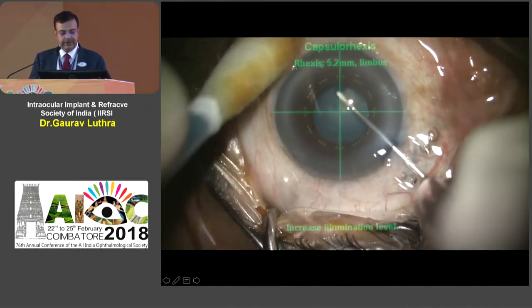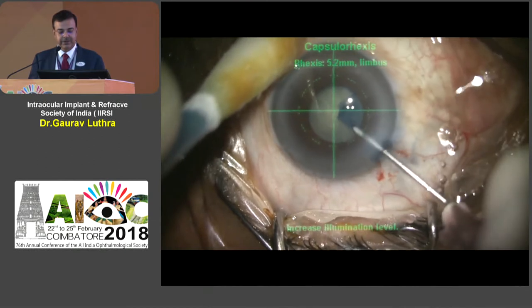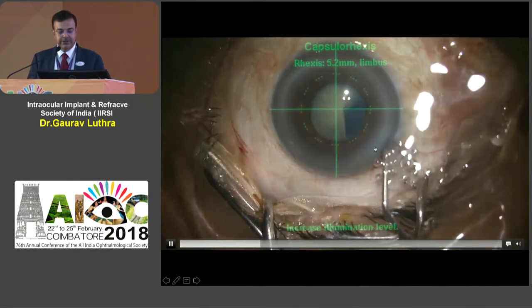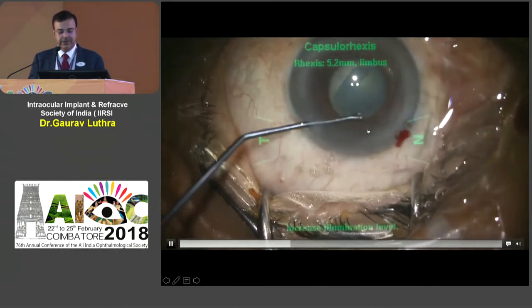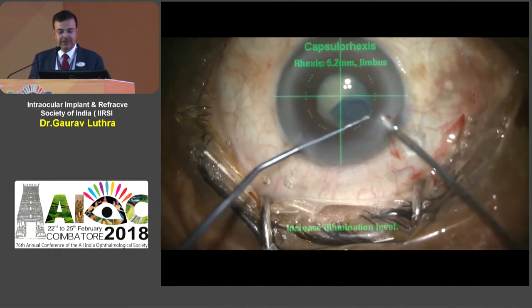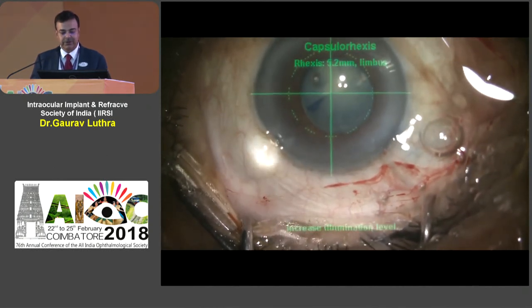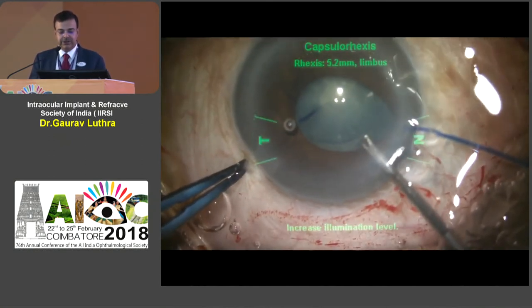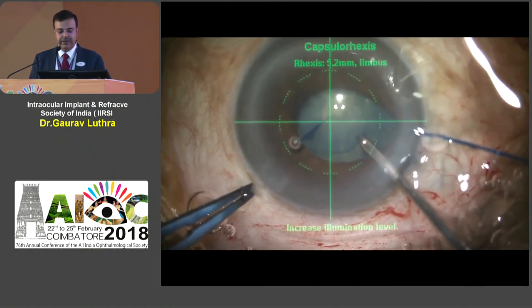Another situation with a smallish pupil — and I do find Verion overlays irritating sometimes because they decrease visualization for the rhexis on video. Again the rhexis tends to run out, and it's right under my main port. I'm using the side port to move the iris aside with the white-tipped spatula, but my two instruments are getting stuck on each other. I try to go from the other side with the micro-rhexis forceps but the approach is not good, so I decide to put in an iris hook. Now I have good visualization — you can always innovate and improvise during surgery — and I'll use the Brian Little's maneuver again.